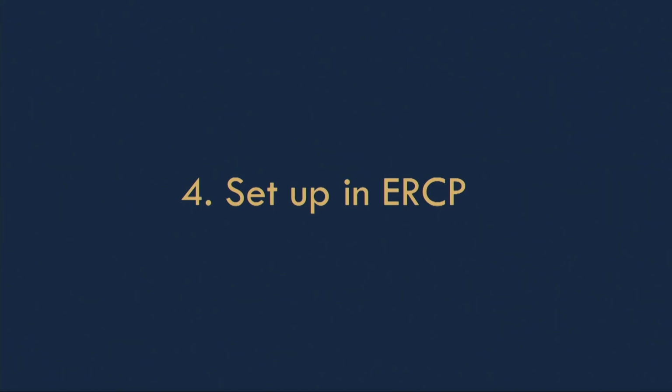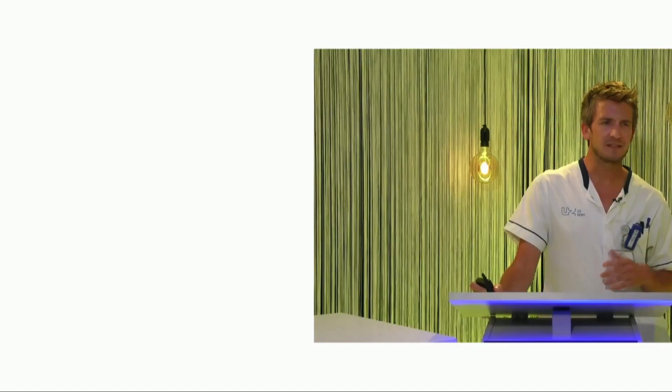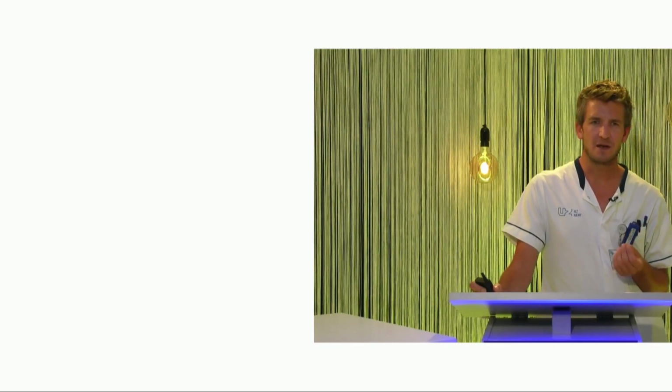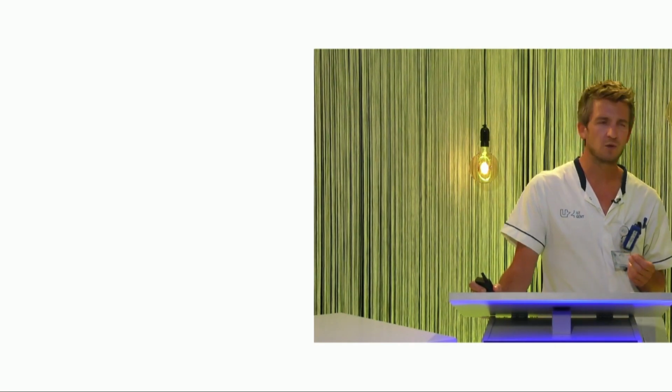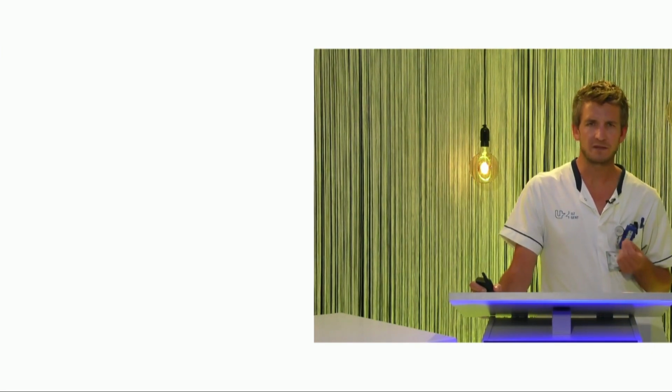To end my presentation, the setup in ERCP. The nurse will prepare some syringes of contrast and some wet tissues, because everybody who is performing ERCP will already notice that after a while it gets a little bit difficult. The wires get stuck, it does not go very fluidly. That's because the wires become a bit sticky because of the contrast.